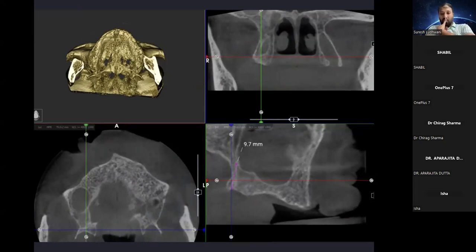Now, the good part over here is, if I'm having any oral surgeon within this chat, in case you are concerned that I'm supposed to raise the flap because I want to see the bone, because many oral surgeons are like, no, I want to see the bone. It's okay. But how can you help with this? When you are doing the virtual implant planning, you can actually measure the angle.